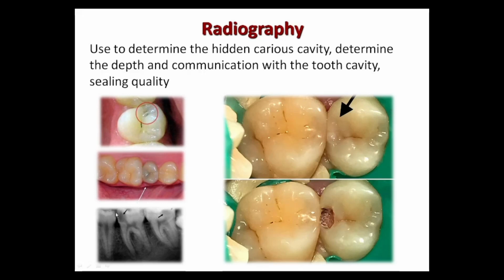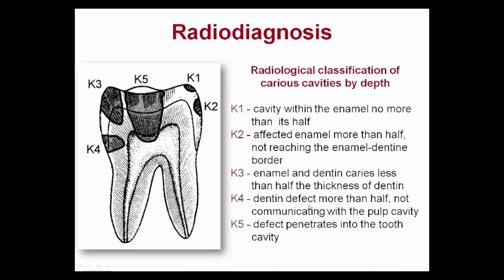And in X-ray picture you can see changes which is caries cavity. So this method, X-ray, helps us to determine caries cavity and its depth. Here, caries cavity you cannot see, and after preparation there exists caries cavity.